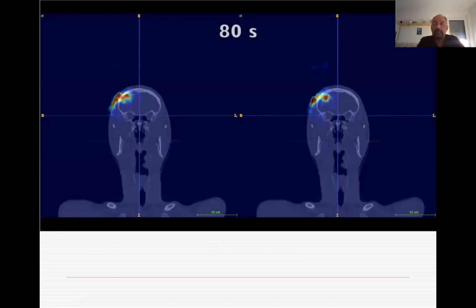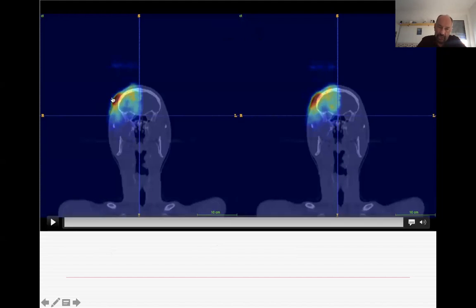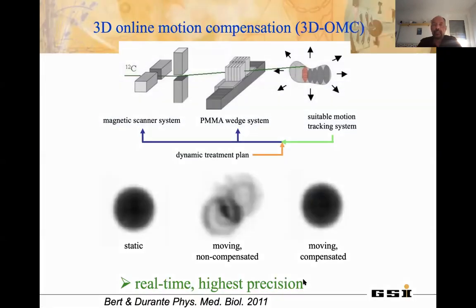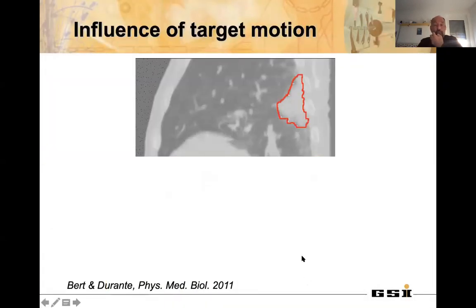With the data and the simulation, you see the total beam, and let's say the position of the Bragg peak that should correspond to the red curve here, the distal part of the Bragg peak. Okay, target motion. Of course, target motion is a big problem.